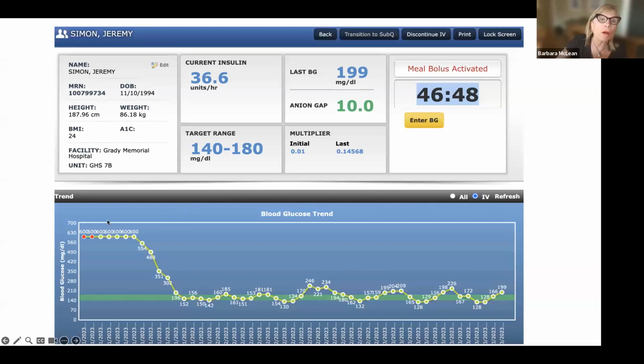So you'll see here that perhaps the nurse wasn't happy with the adjustment. Maybe they didn't know better, but it was 600 and 600 with the red dot. That means we told the glucometer it was meter max. And then the nurse actually put in 600, which then told Glucommander to adjust.